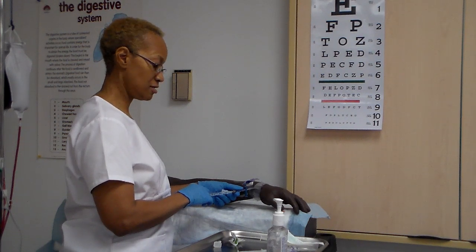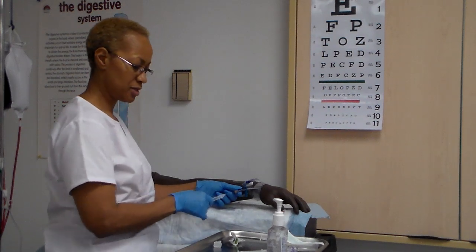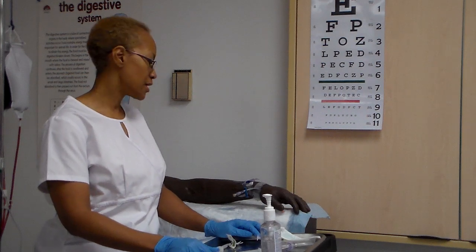You see that being done? Probably not. Okay? But make sure that you do it, because that's the way it's supposed to be done. It's all about client comfort. Heparin flush option. Insert needle of syringe containing heparin through diaphragm. Inject heparin slowly and remove syringe. My facility doesn't use heparin.